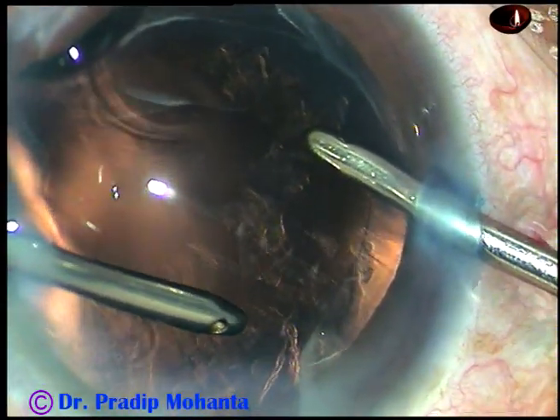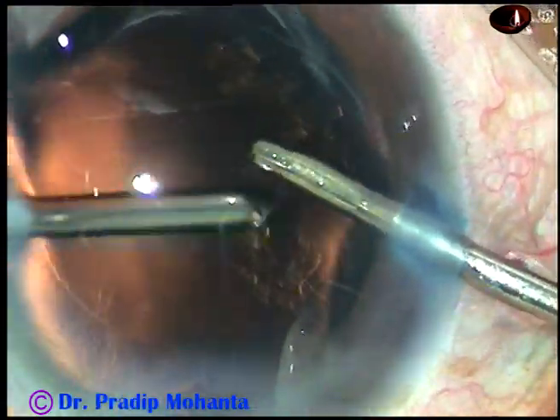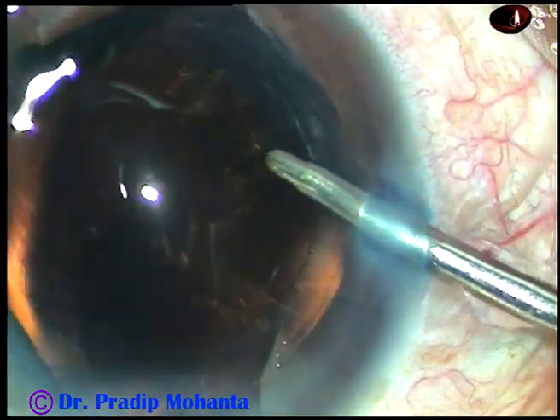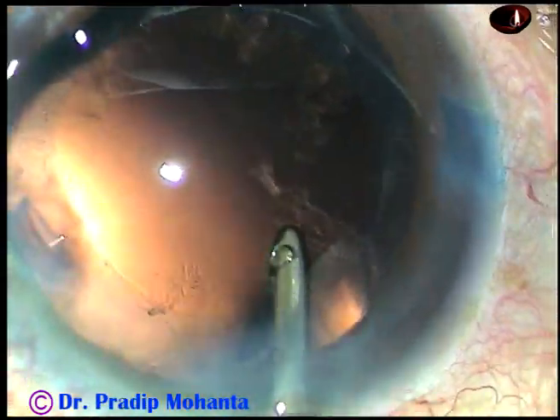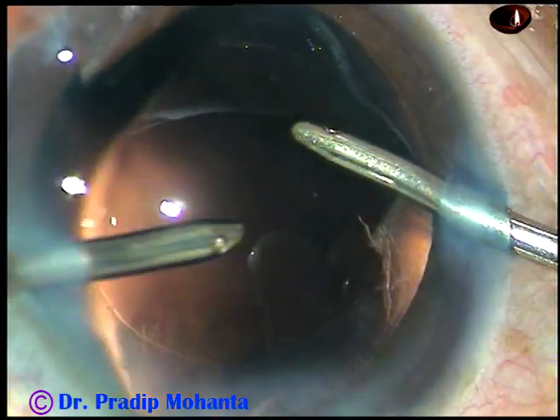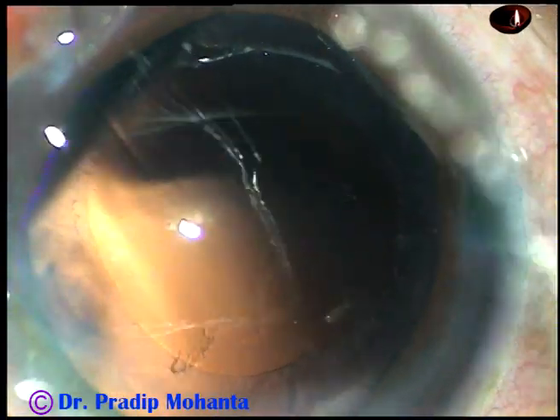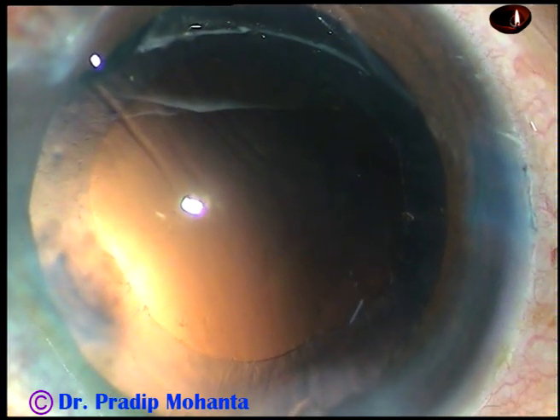It is slower in my hands because I use it occasionally. Irrigation is through the right side port, aspiration from the left. There are some lens fibers sticking to the posterior capsule. I am pulling the fibers from the equator. Now I am using only irrigation to dislodge the cells — just by irrigating you can dislodge cells from the posterior capsule. After irrigating we can go to I/A mode 2 and remove these loose cells. Hydration loosens these fibers and then we can easily remove them. Sometimes we have to increase the vacuum, usually 20 to 30, up to 50 mmHg.